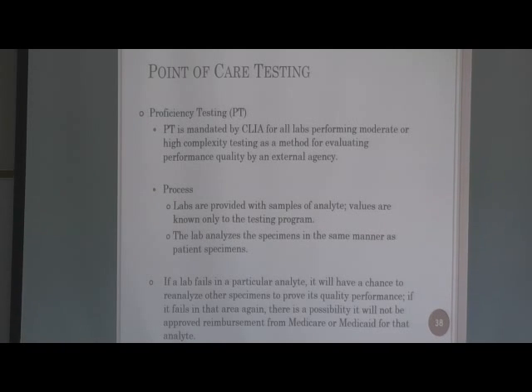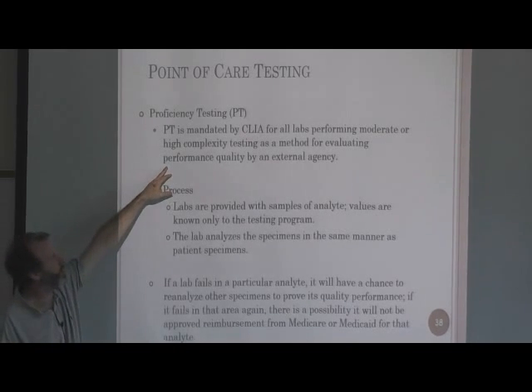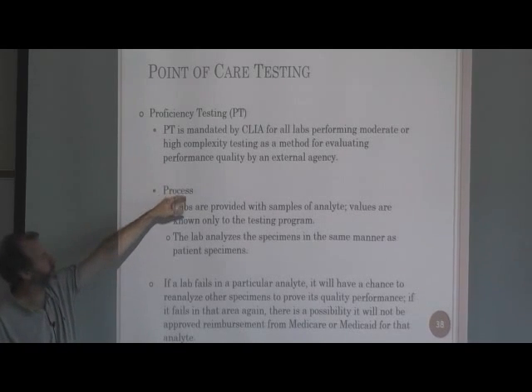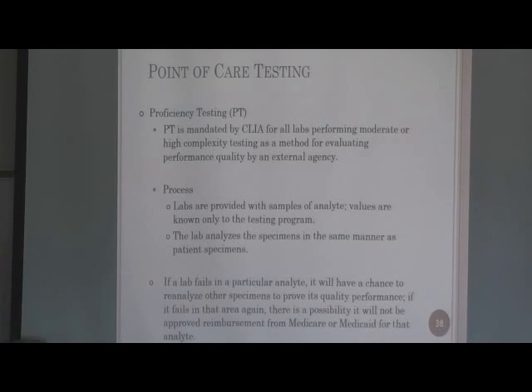Proficiency testing is mandated by CLIA for all labs performing moderate or high complexity testing as a method for evaluating performance quality by an external agency. And we talked about this, right? Labs are provided with samples of an analyte. Values are known only by the testing program, and then the lab analyzes the specimens the same manner as patient samples. And then they get the results back.